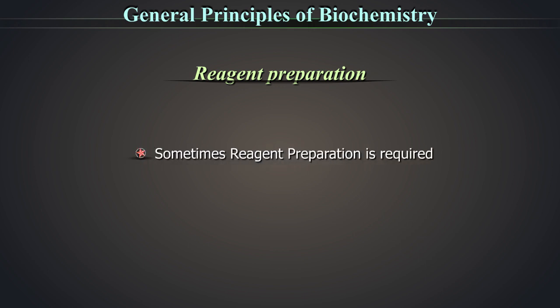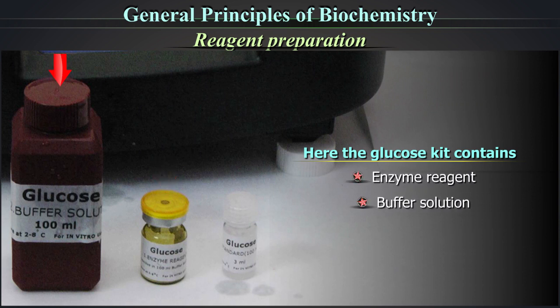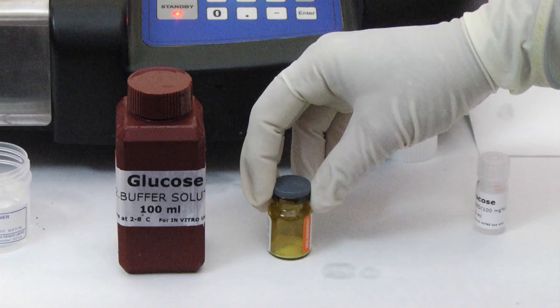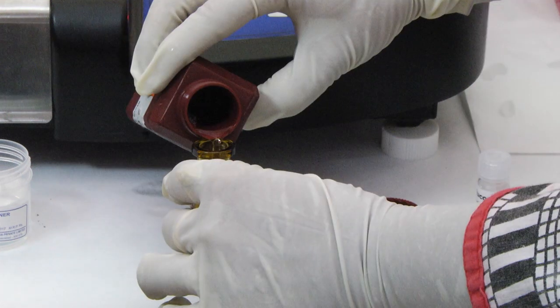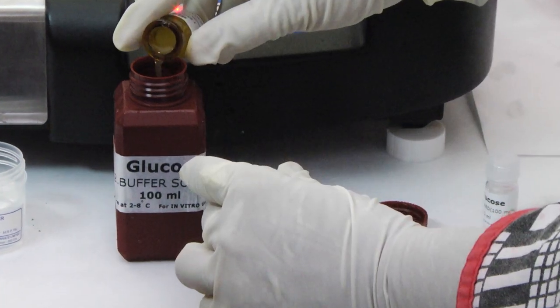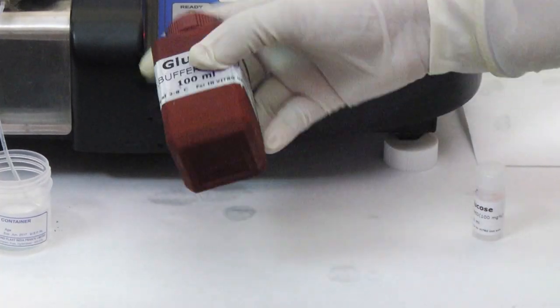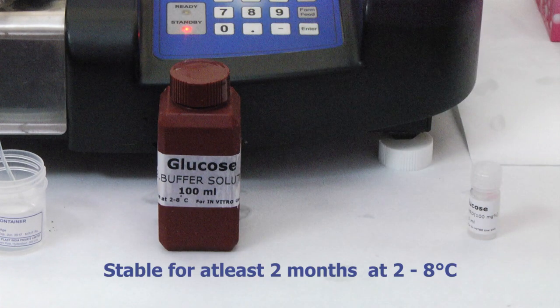Sometimes reagent preparation is required. Here, the glucose kit contains enzyme reagent, buffer solution, and standard. To prepare the reagent used in this test, dissolve one vial of enzyme reagent, which is in a powdered form, in one bottle of buffer solution. Dissolve the powder with buffer solution and then pour the entire amount into the buffer solution. Mix gently to make it homogeneous. The prepared working enzyme reagent is stable for at least 2 months at 2 to 8 degrees Celsius.